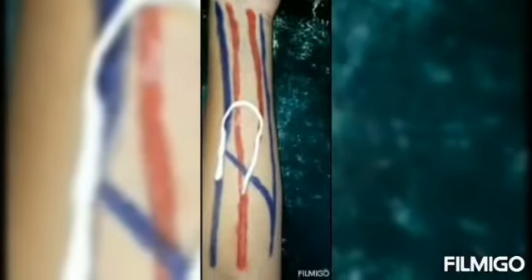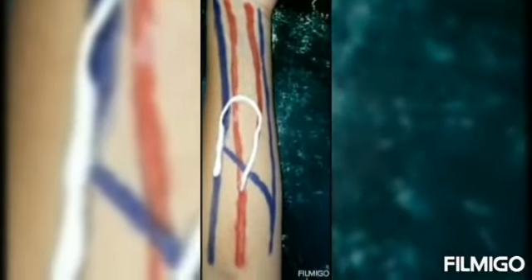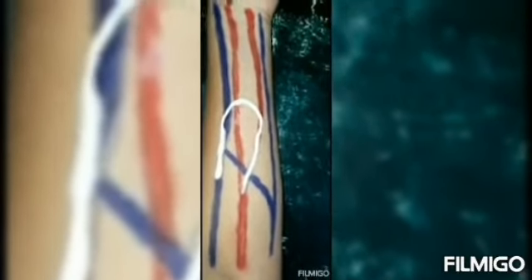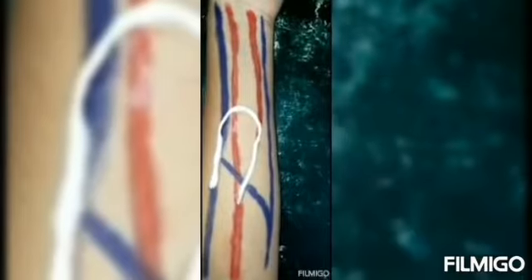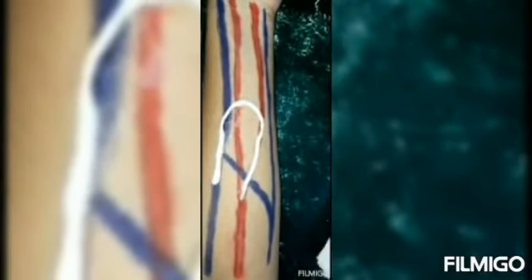So now let's see about the other method of hemodialysis, AV graft. This is the type of access used for people who cannot have an AV fistula. The graft is usually placed in the arm, but it may also be placed in the leg if necessary. AV graft is a connection of vein and artery that utilizes a hollow synthetic tube. The AV graft is usually made of the synthetic material polytetrafluoroethylene. The graft is inserted when the patient's native vasculature does not permit a fistula.